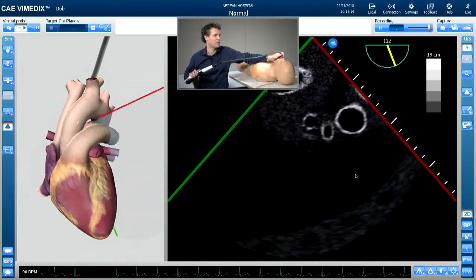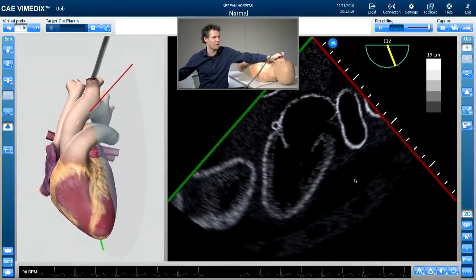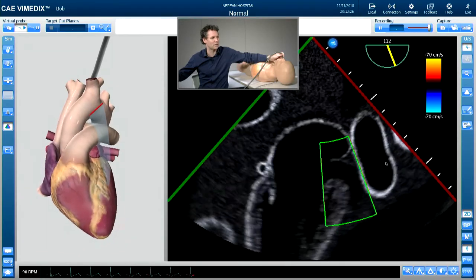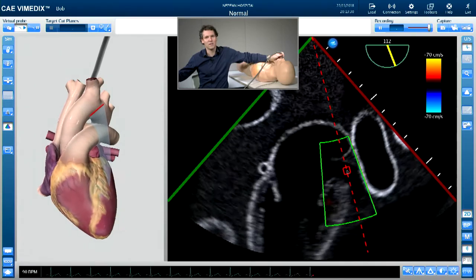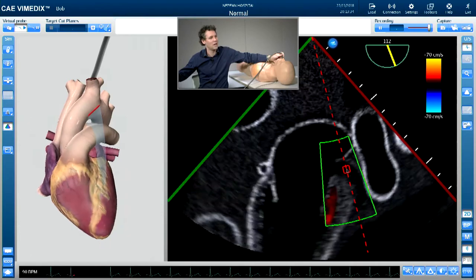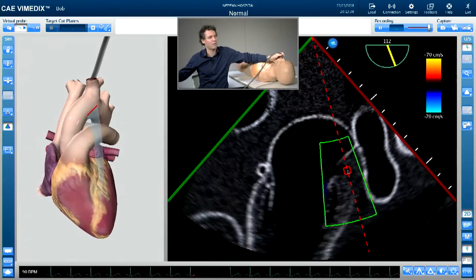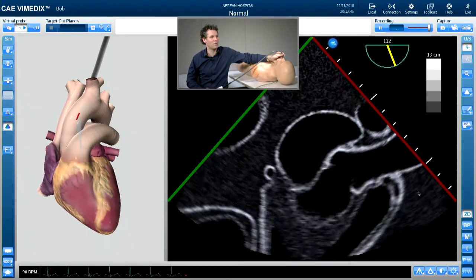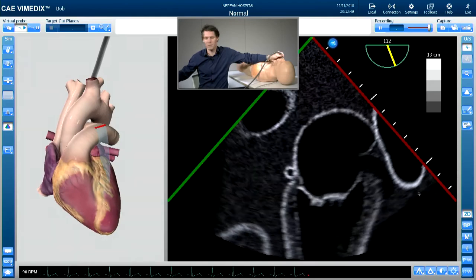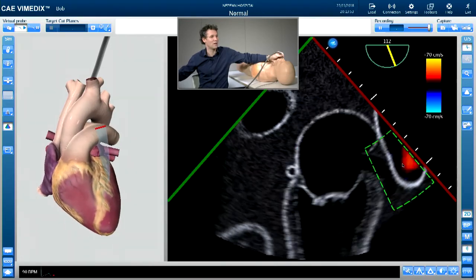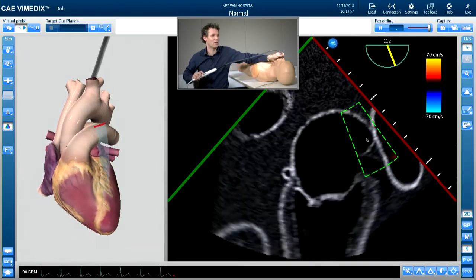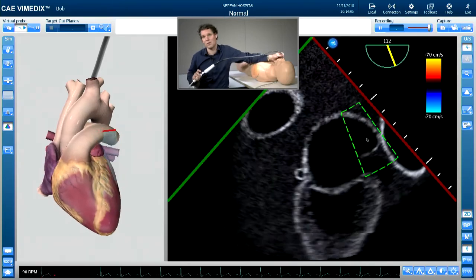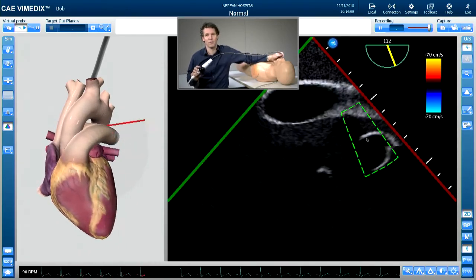Looking at the left atrial appendage, I zoom in, apply colour flow with the scale turned down to look for slow flow, and use pulse wave Doppler within the appendage. If flows are less than 40 centimetres per second, that suggests impaired flow. At the same level you can identify the pulmonary veins — particularly the left upper pulmonary vein near the Coumadin ridge. Pulse wave Doppler interrogation of the pulmonary vein helps assess left atrial pressures and whether there's significant mitral regurgitation, such as systolic flow reversal.